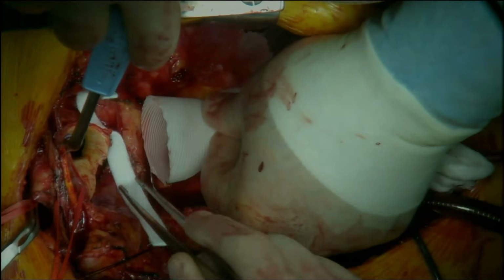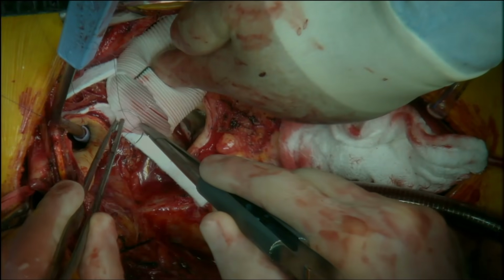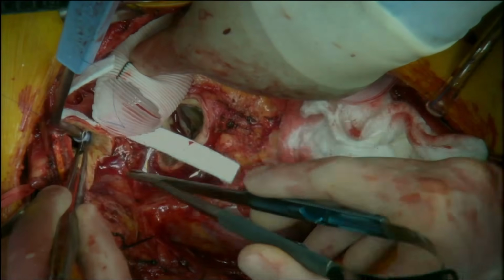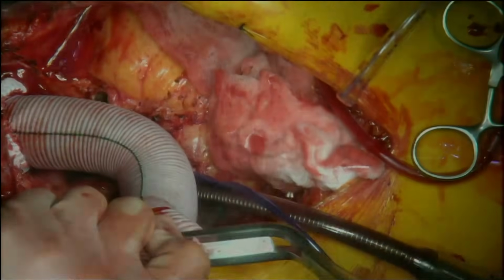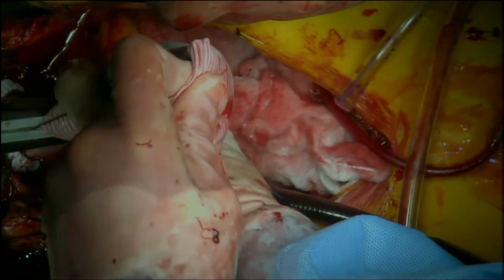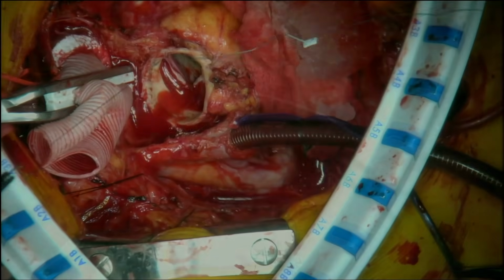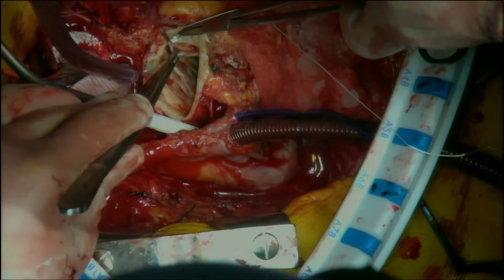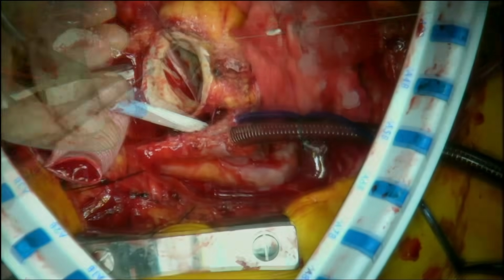A Dacron graft is used to create the open distal anastomosis, reinforced with Teflon felt. The graft is clamped proximally, trimmed to the desired length, de-aired, and used to restore circulation. While rewarming is started, attention is turned to the proximal aorta, where interrupted sutures are placed circumferentially around the aortic annulus.